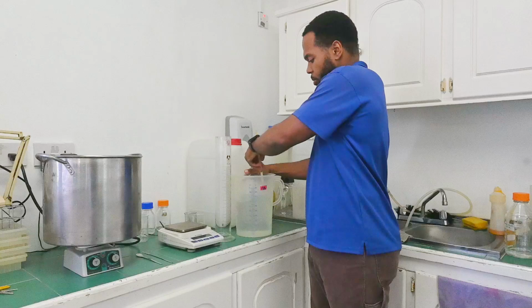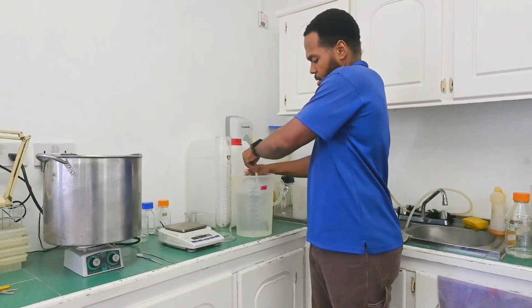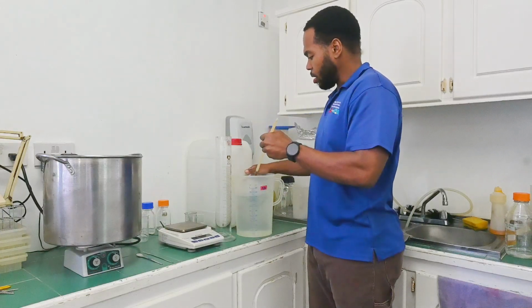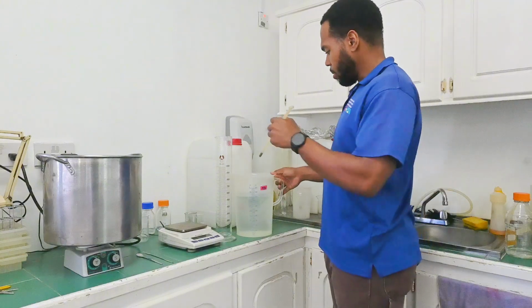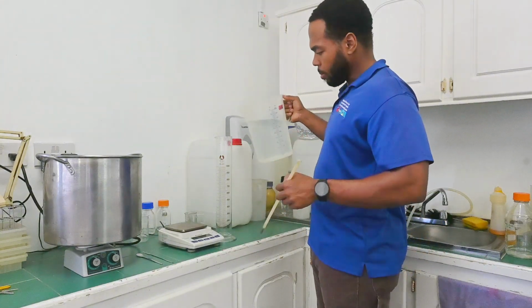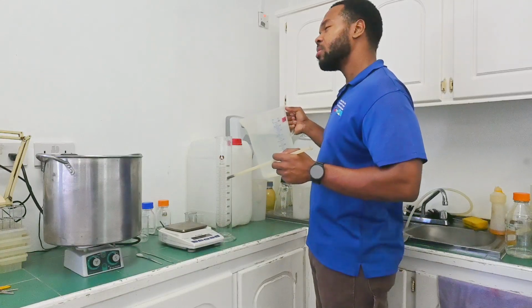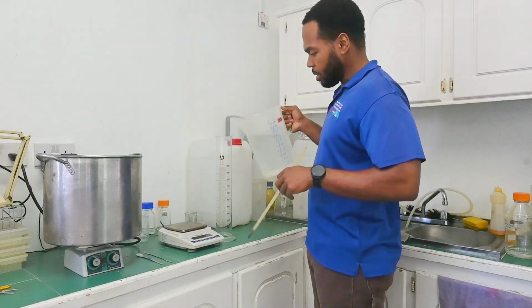The first stock solution we're going to add is MA, that's your macro elements. That's some of the most essential ones for the growth medium. We make sure we stir it first to ensure that whatever we pour in is uniform, and you have to add 100 milliliters per liter.